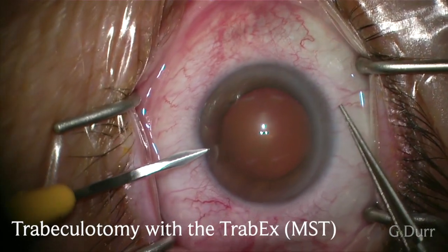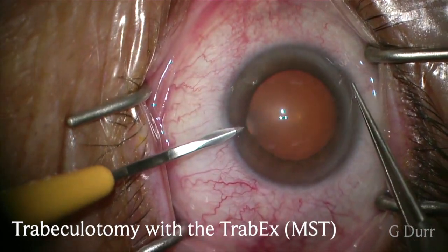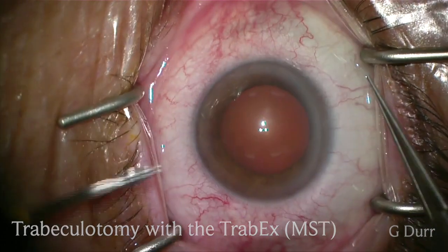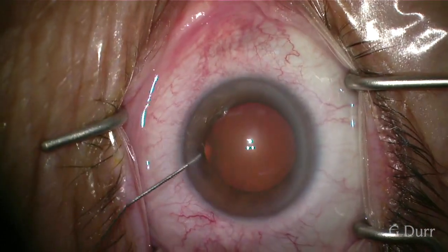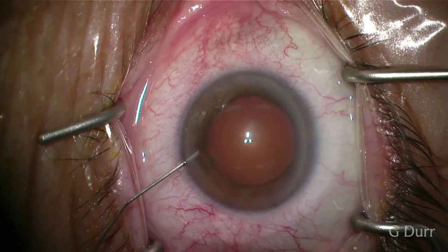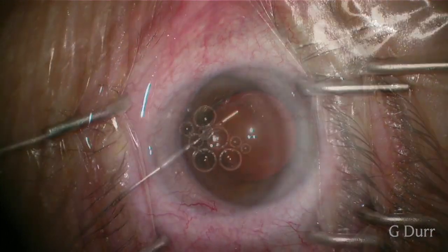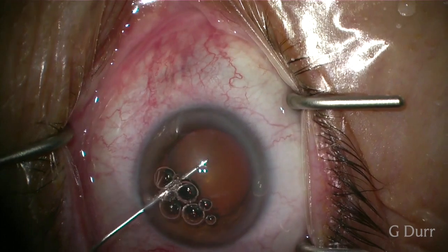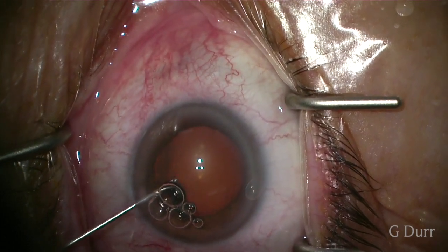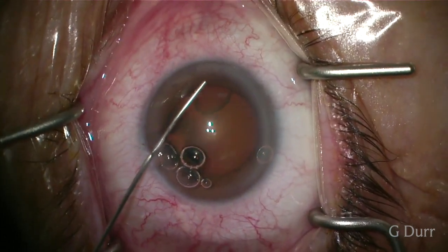This video describes the trabeculotomy using the Trabex by MST. We start with a side port incision and then inject some lidocaine into the anterior chamber. We then inject our viscoelastic, with a dispersive injected first and then a cohesive that is targeted in the nasal angle.